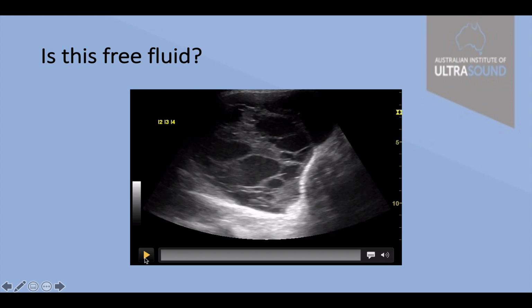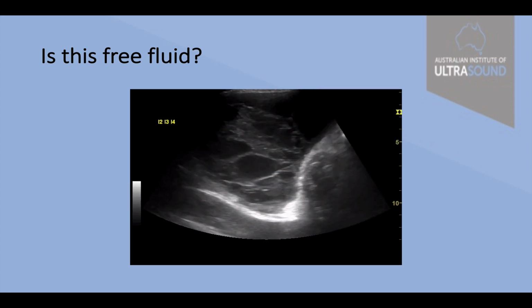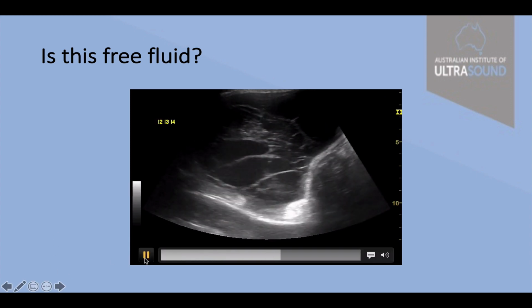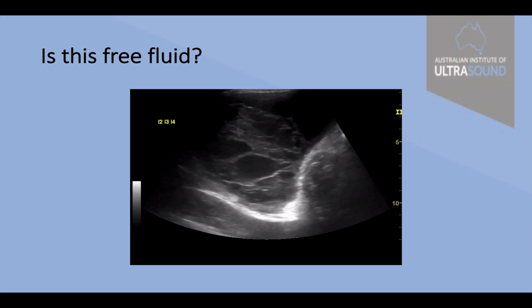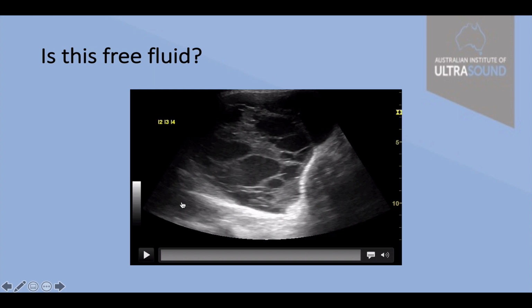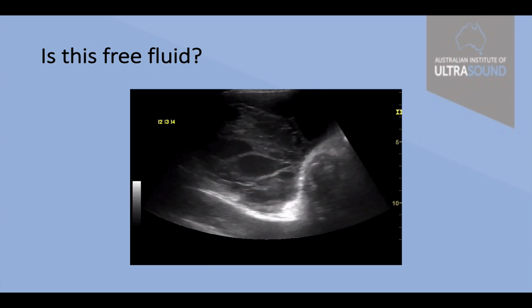Here's another one. This is the base of the right lung. Beautifully, we can actually see the descending thoracic aorta. It's a rare sighting going across the bottom of the screen. The diaphragm's on the right, but as you can see, there's a web-like echogenic structure in the middle. That was a chronic hemothorax with some organization.